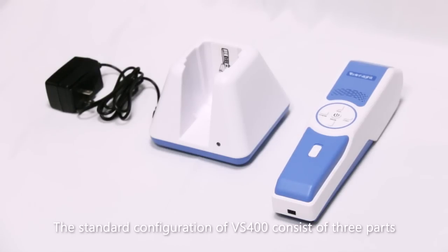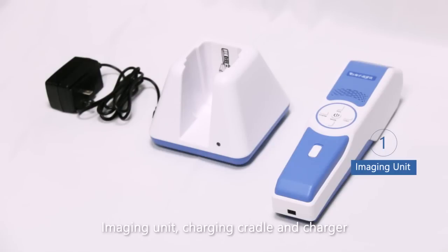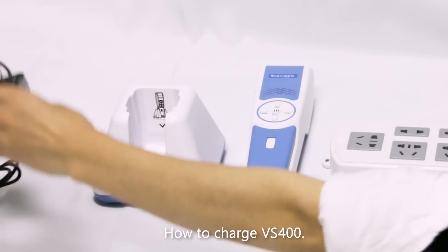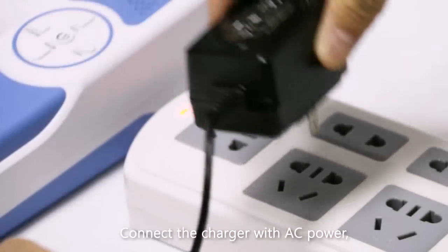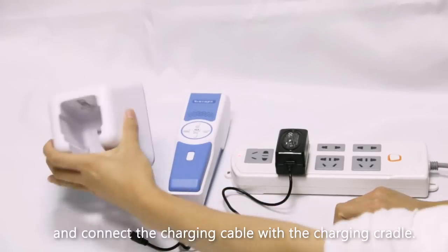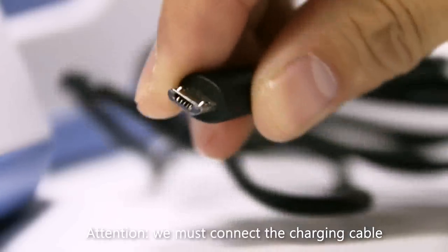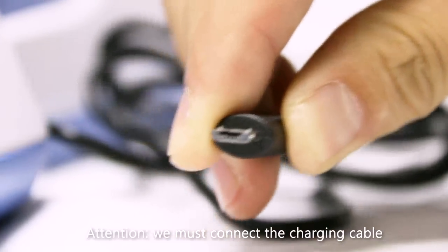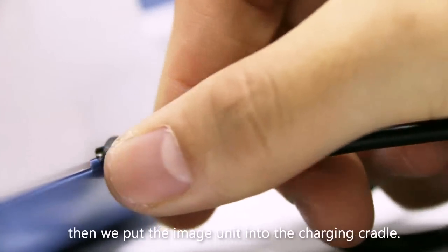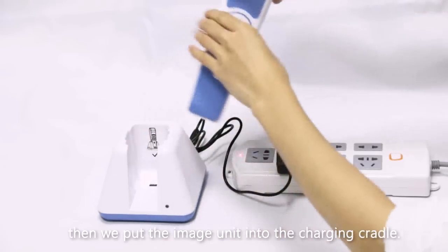The standard configuration of VS 400 consists of three parts: imaging unit, charging cradle, and charger. To charge VS 400, connect the charger with AC power and connect the charging cable with the charging cradle. Attention: we must connect the charging cable with the charging cradle only in this direction.